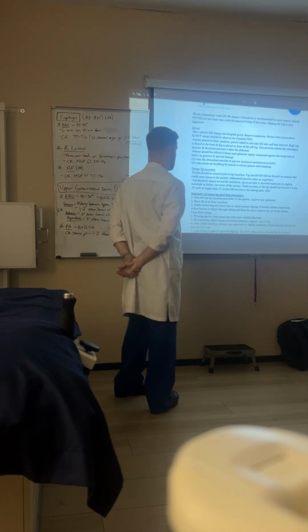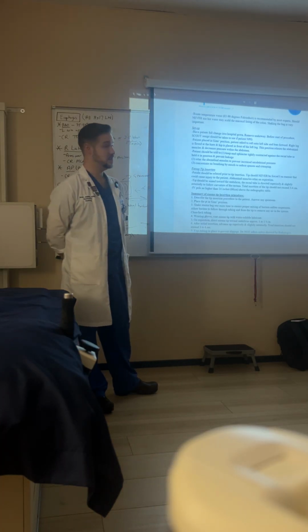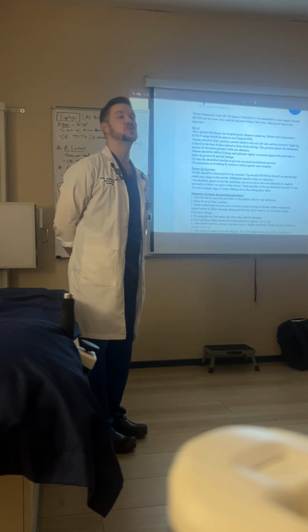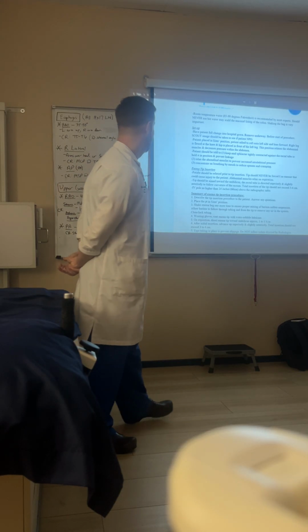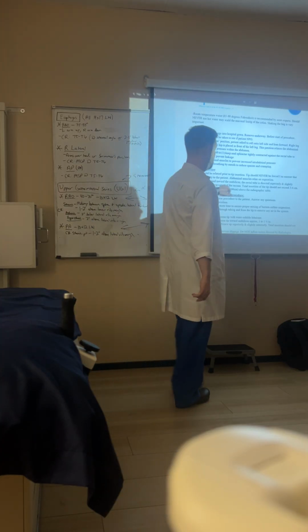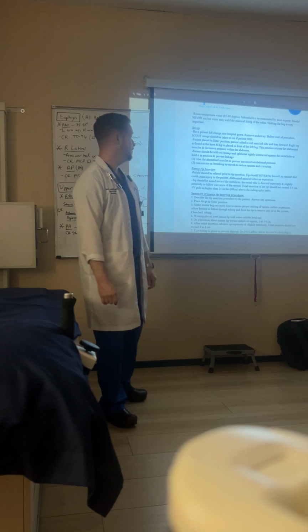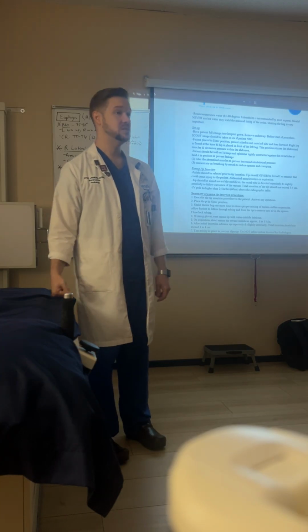For the enema tip insertion, the patient should be, again, in the Sims position. They should be relaxed prior to the tip insertion. They shouldn't be like, oh my God, right? We need everything nice and chill. The tip should never be forced in a manner that should cause injury to the patient. The abdominal muscles should relax on expiration.